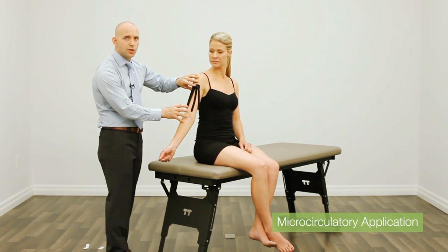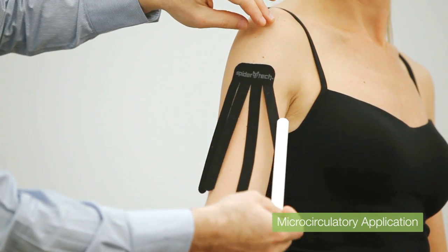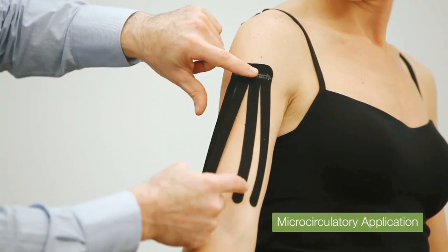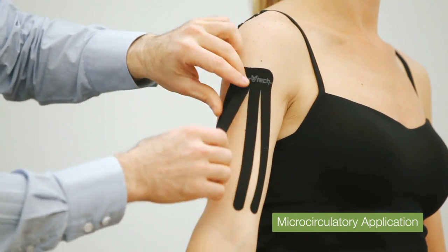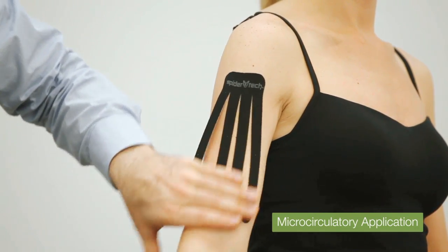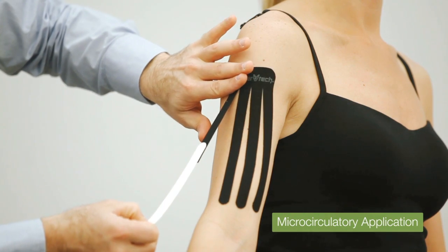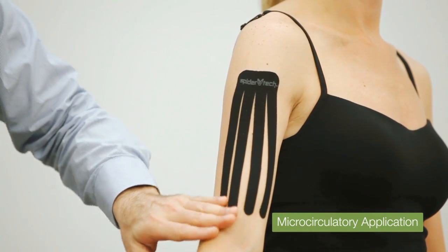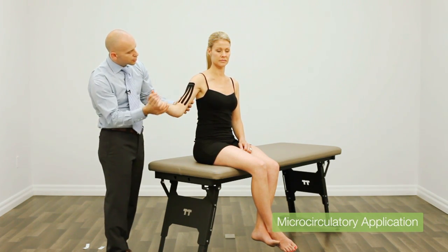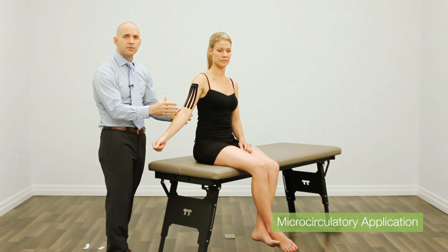If the patient was unable to go through that range at all, keep them in a comfortable position. Peel the backing, with tension pulling the backing off the tape, then come behind and lay the tape down in contact with the skin, leaving a little bit of space in between each projection. Wait until 90% of the tape is applied, remove the backing, and rub over top. This demonstrates a micro circulatory application for the upper arm. We can do this anywhere throughout the body that you have any type of swelling, bruising, or edema.